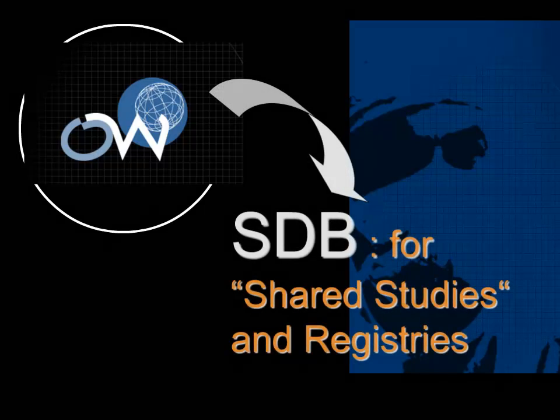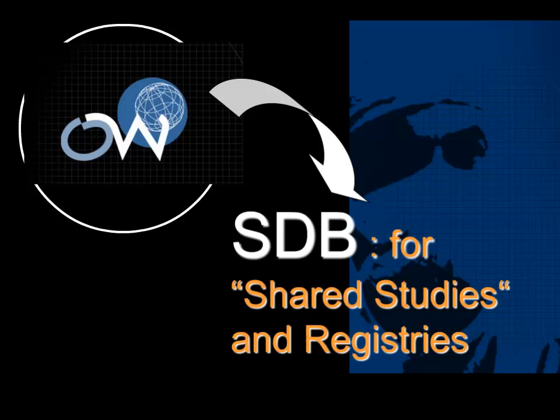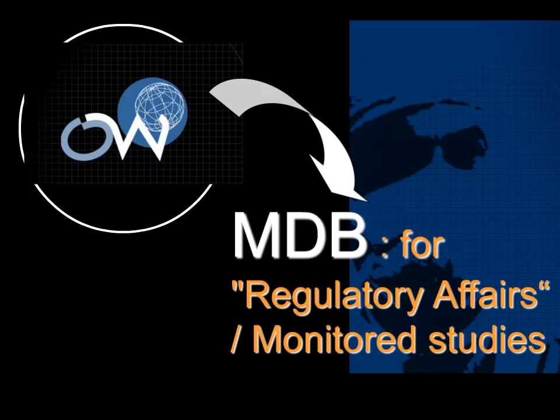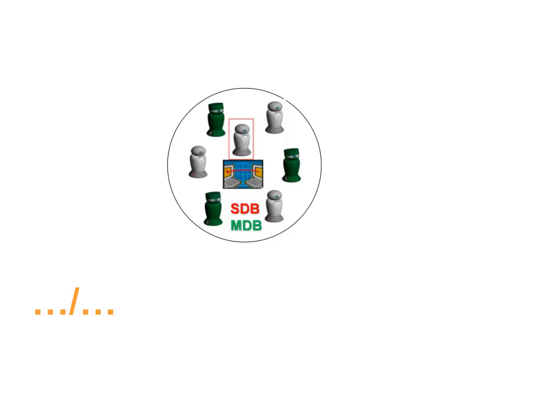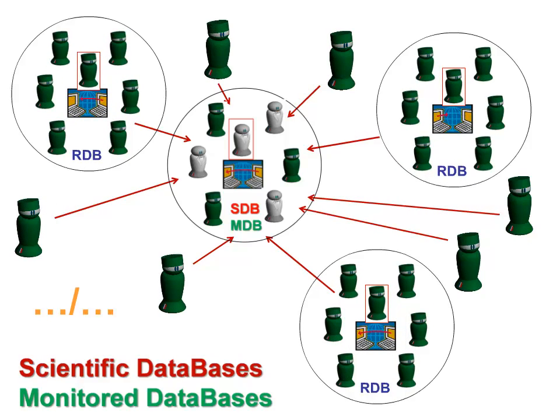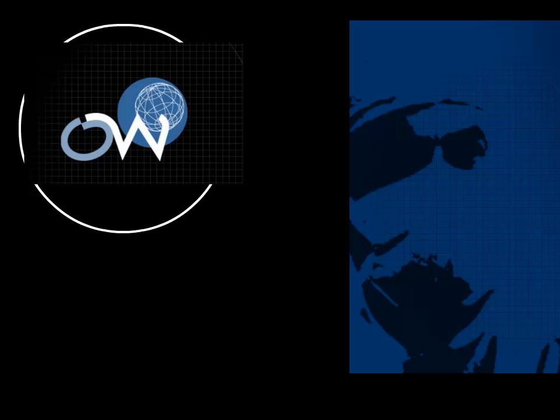The scientific databases share selected data provided from several regular databases under a de-identified mode and are specifically tailored for local or national registries. The monitored databases are linked to one or several regular databases for specific implant studies and regulatory matters. As an example, we can see a MDB or SDB with its own local administrator, linked to either isolated surgeons or regular databases.